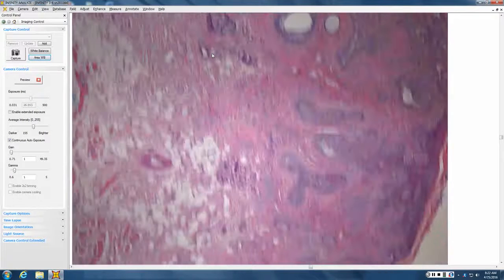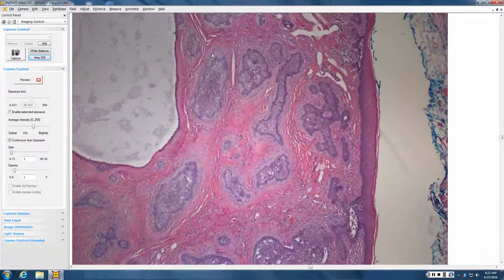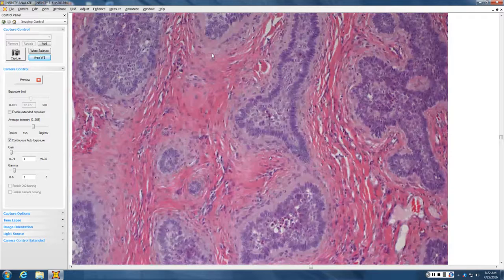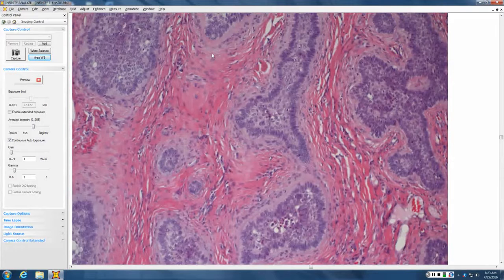Tissue here. See these nodular aggregates of infiltrating cells that palisade at the periphery. It's like lymphadenoma, except that the center is not lymphs and histiocytes.